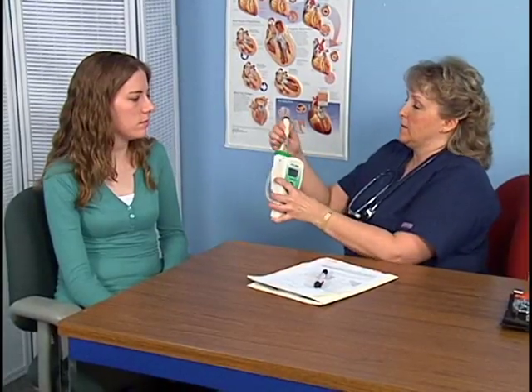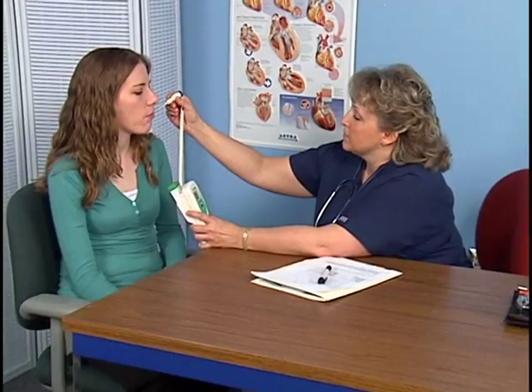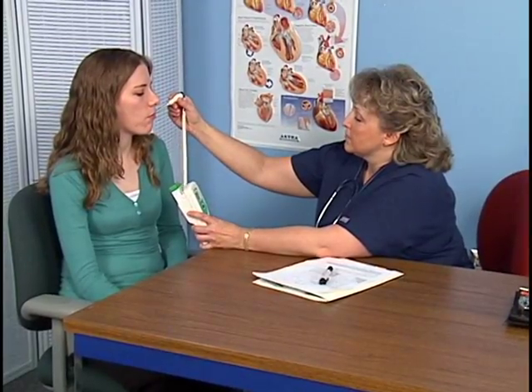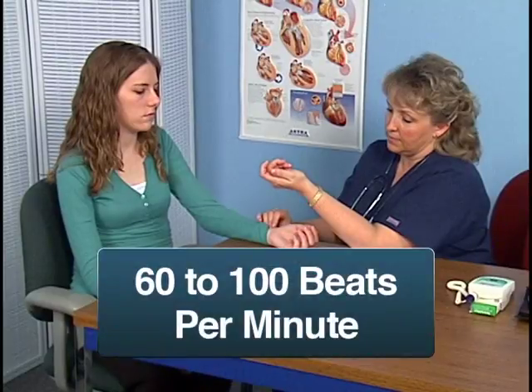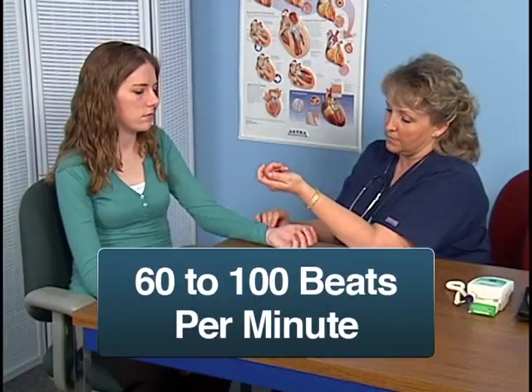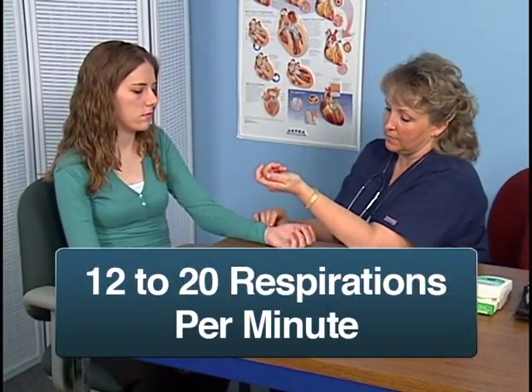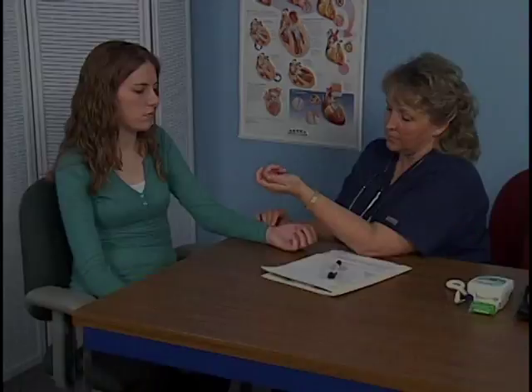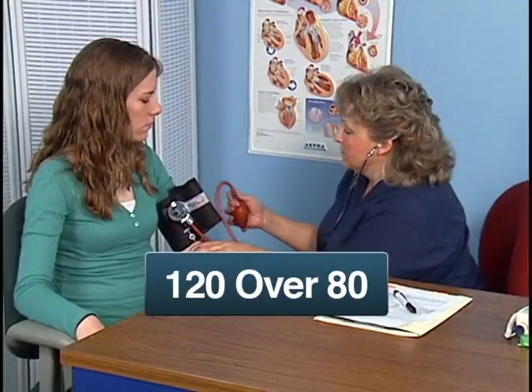Next, measure the patient's vital signs and chart the results. Determine if they fall within normal range. Normal body temperatures fall between 97 to 99 degrees Fahrenheit. The normal pulse rate of an adult is 60 to 100 beats per minute. The normal respiratory rate of an adult is 12 to 20 per minute. And normal blood pressure is a reading lower than 120/80.